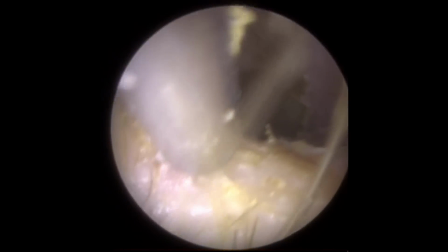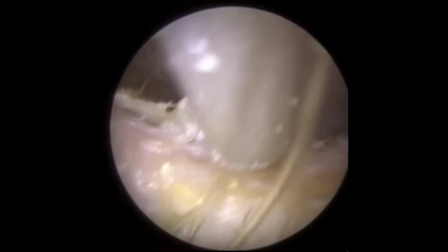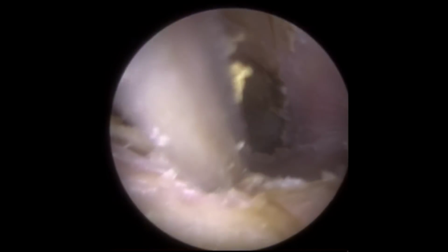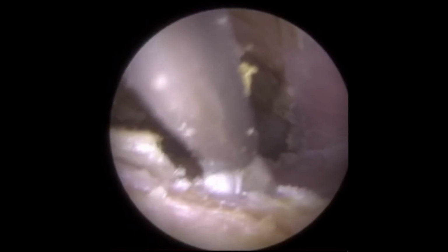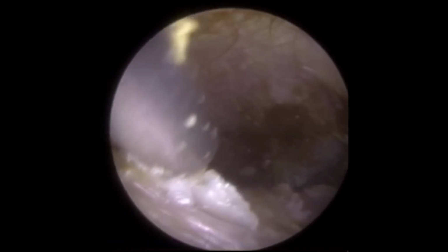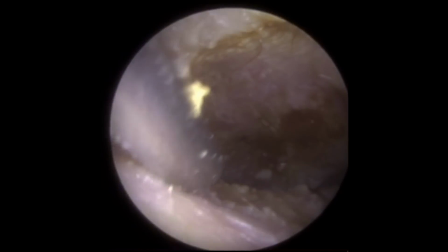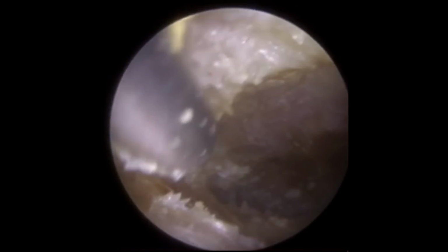Just thought I'd mention as well, sometimes when you've got dead skin you can put some drops in the ears to loosen this skin, make it damp. However, in this particular case I was very reluctant to use drops if at all possible, and that's because the patient has got obviously otitis externa, outer ear infection. If you're going to use drops for dead skin, the best type of drops is sodium bicarbonate drops, which is slightly alkaline and water based.